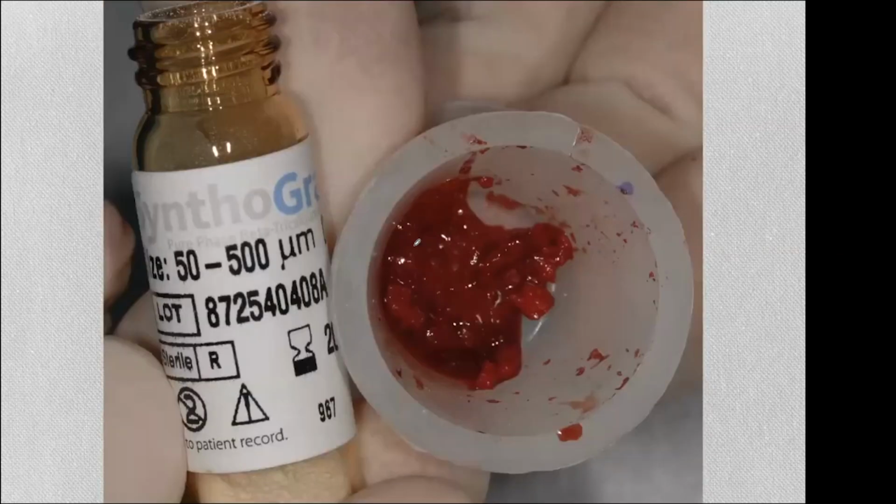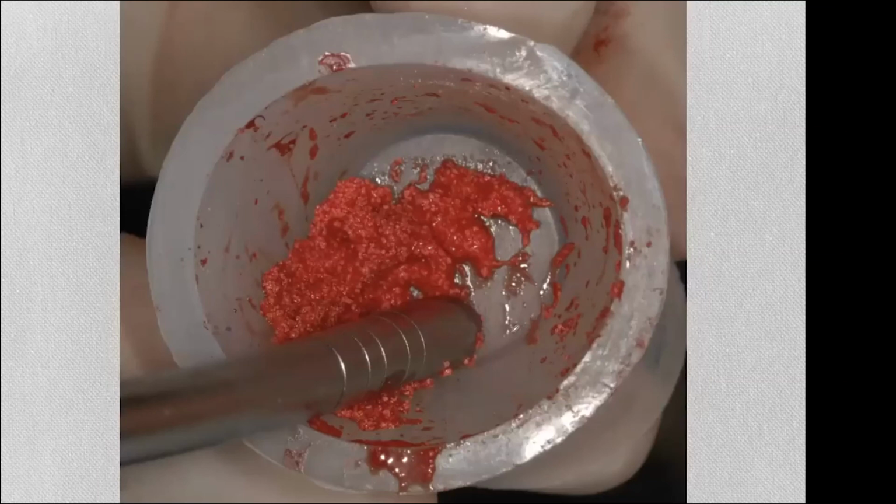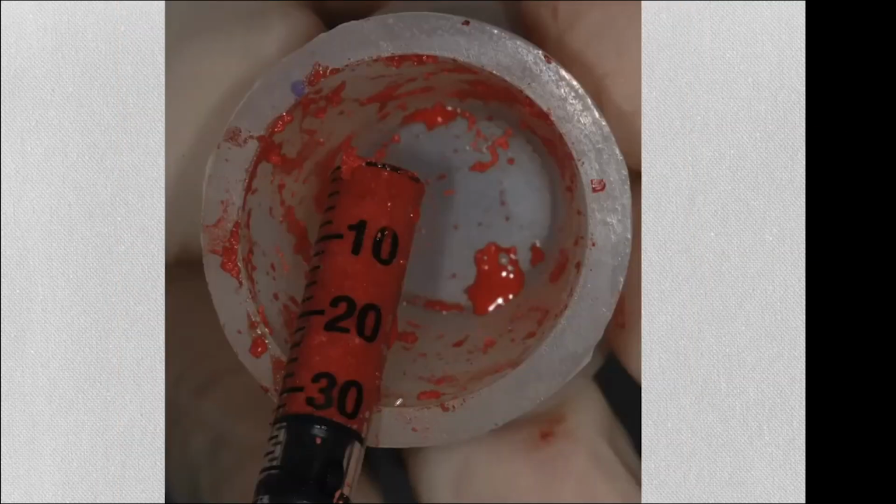Now we mixed 1/4 gram, you can't see it here, but it's a 1/4 gram with all of the bone and the blood and so on. We ended up with a total volume of about 1/3 of a milliliter. And so that reinforces our kind of notion that with SynthoGraft fine, the numeric value of the weight is kind of indicative of the volume you're going to get if you wet those particles together. And 1/4 milliliter is a significant sinus lift for one implant.